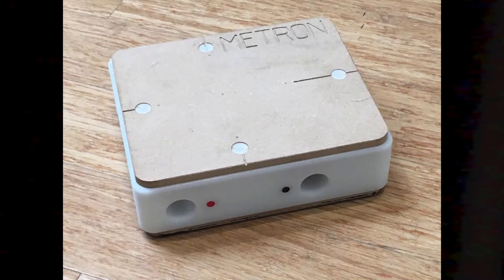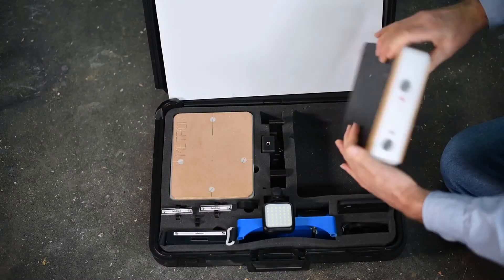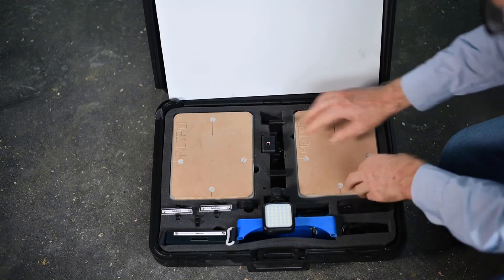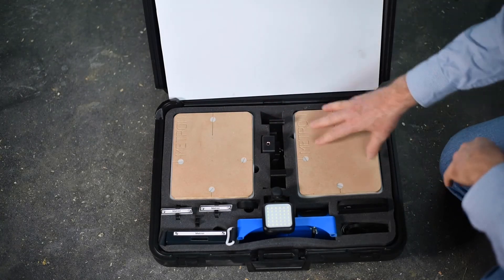First of all, there are two Metron blocks. These are blocks that you stand the horse's foot on. This goes to the ground; this is where the horse is stood. There are calibration features on the sides — two of those, so both feet can be at the same height at the same time.